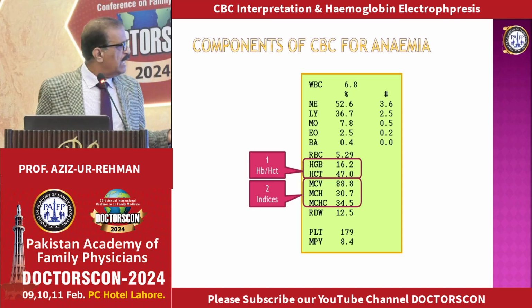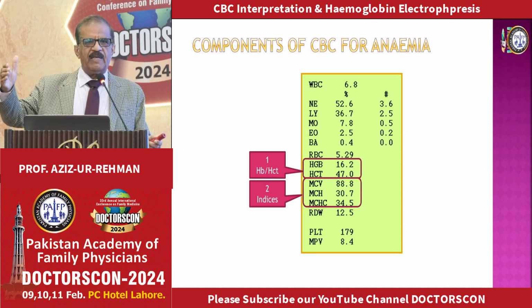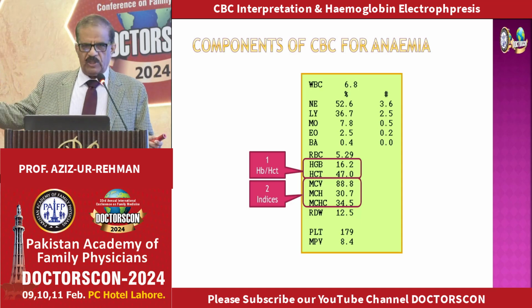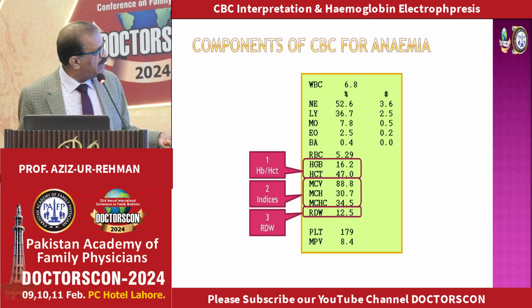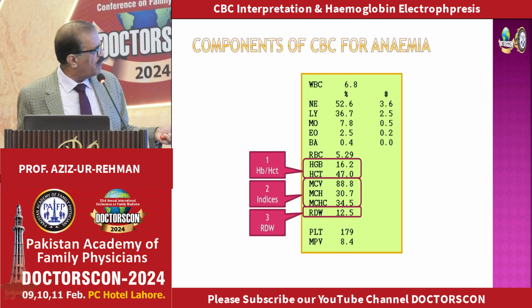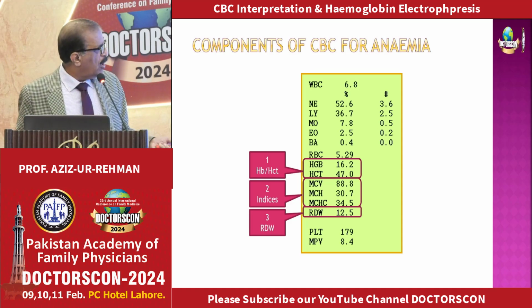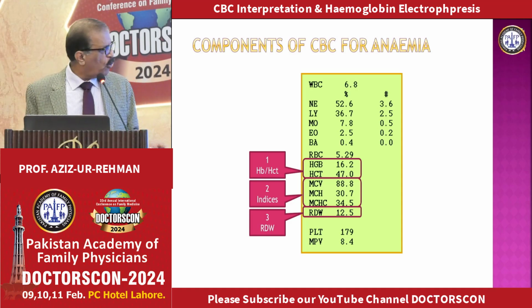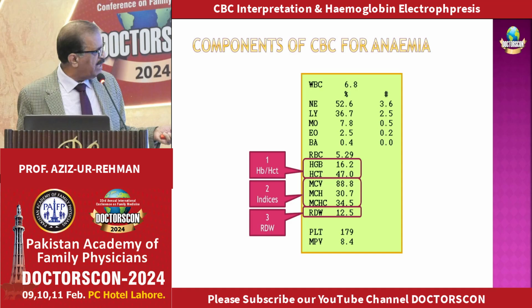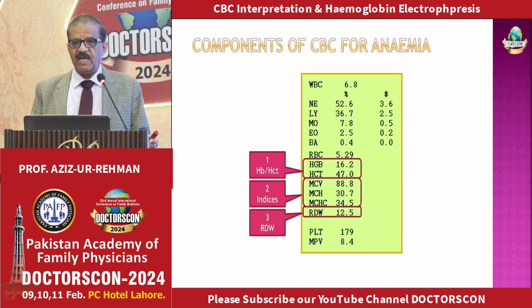First step is to see hemoglobin or hematocrit. Of course, you need to have low hemoglobin and low hematocrit first to diagnose anemia. And second, we go to this panel and we decide the morphology. On the basis of MCV, we'll see if the patient has microcytic or normocytic or macrocytic. On the basis of MCH, we will decide if it is normochromic or hypochromic. And the third step, RDW, will tell us which of the 2 hypochromic microcytic anemias this patient might have.